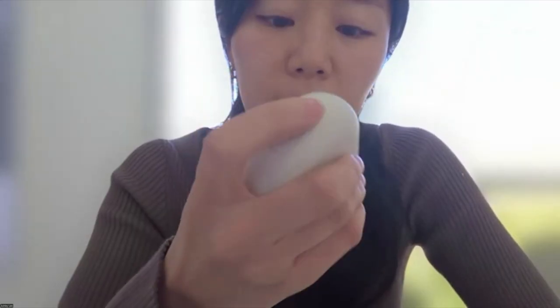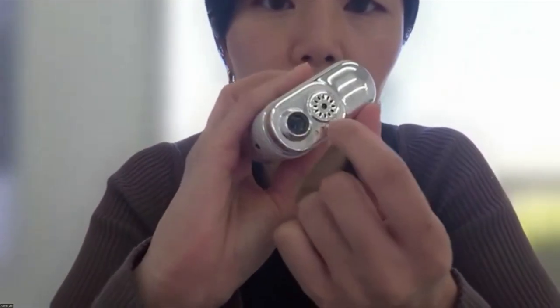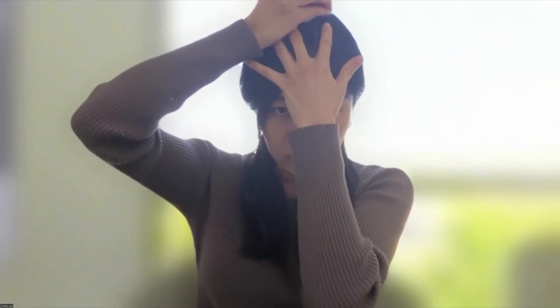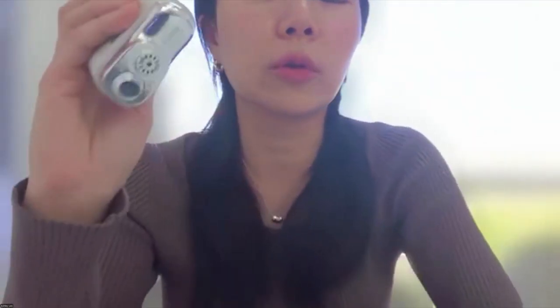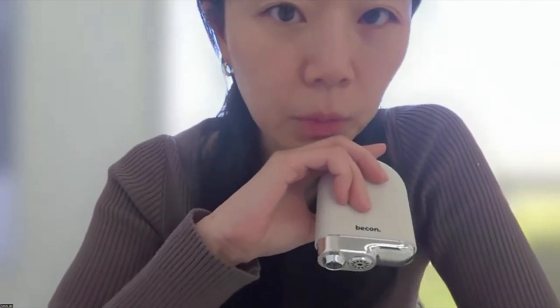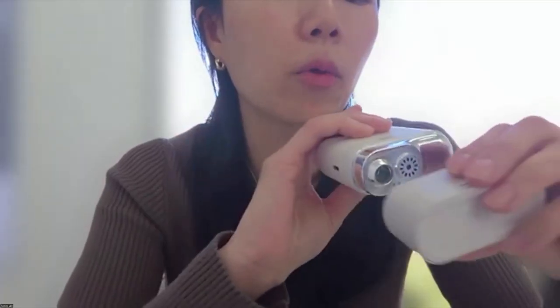You should grab it like this, and then based on the sections, you're going to directly attach this lens part onto the scalp at 90 degrees and try to aim for a clear follicle image in order to do the focus points. So capturing the correct image is crucial. We recommend doing practice before you actually arrange the meeting with your end clients.